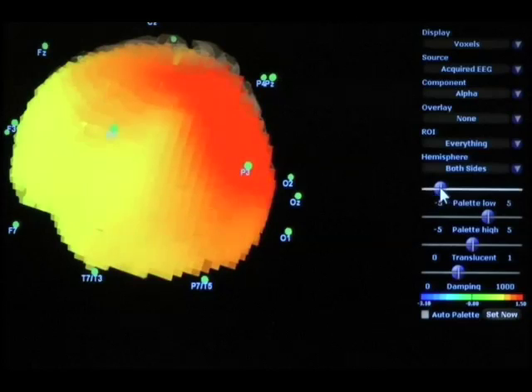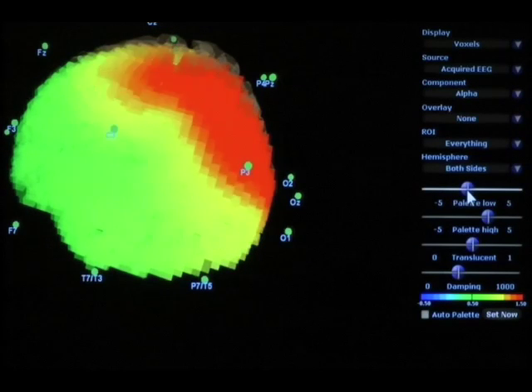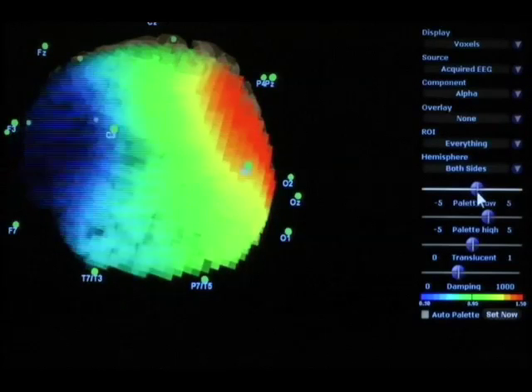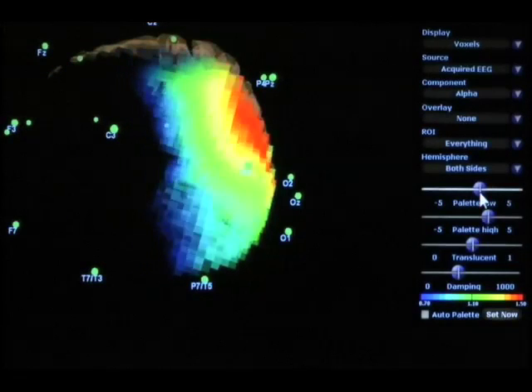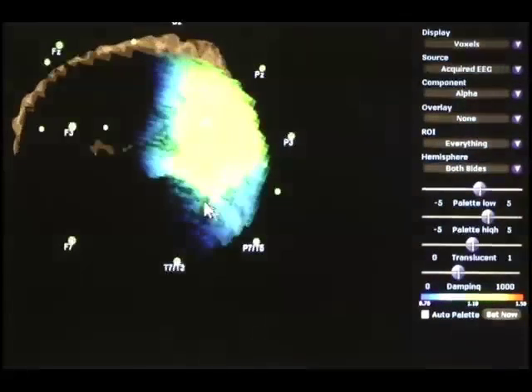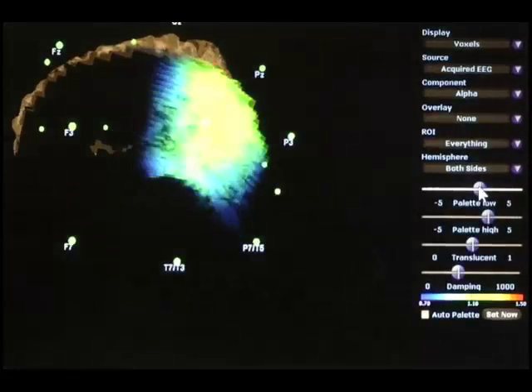If I slide palette low forward, to the right, the graph begins to turn green, blue, and if I slide it far enough I can actually get a lot of the voxels to turn black and disappear. That's because I've set palette low at a high value.